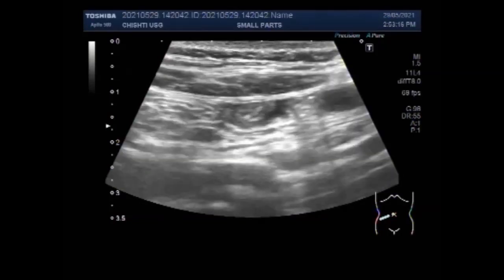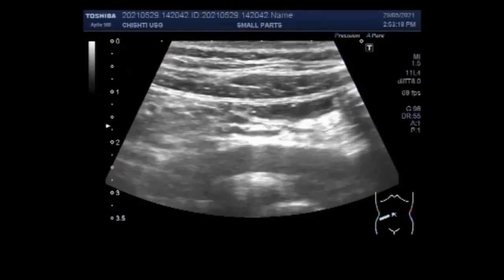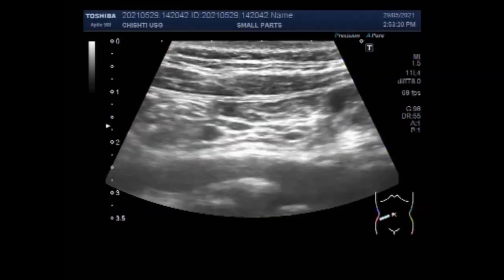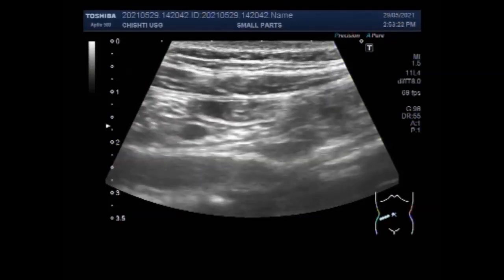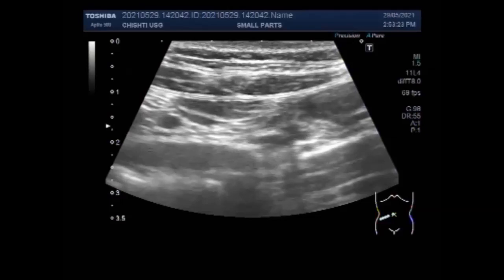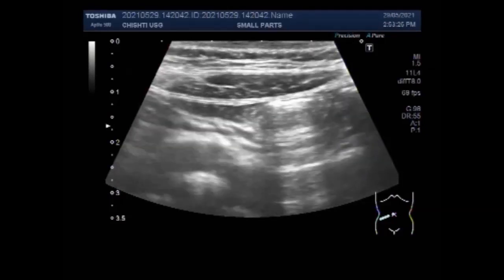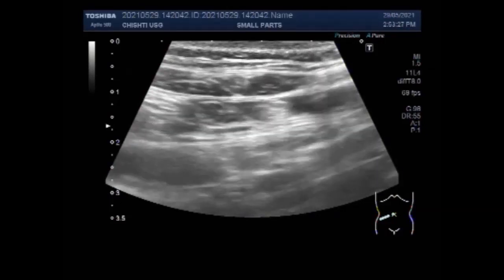This is the third video and you will see the worm movements as the worm is seen in the gut loop.